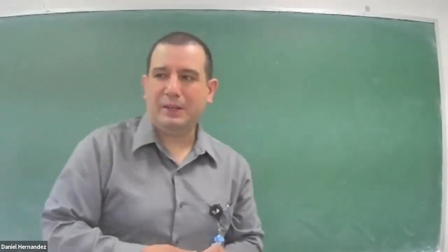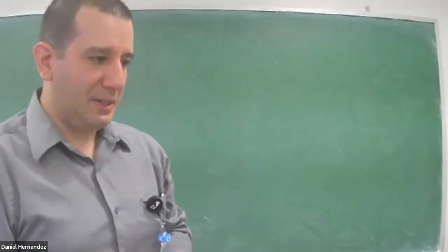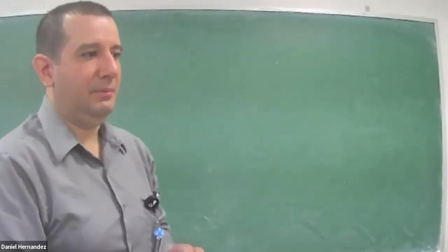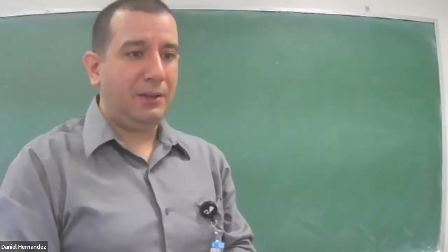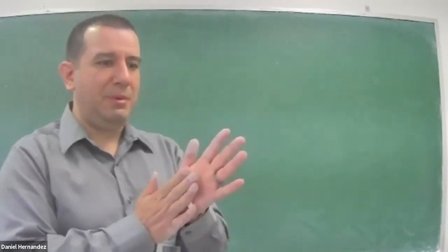Oftentimes the pediatric radiologists are going to come in. A lot of times they'll be present for these exams. Sometimes they may want to scan them themselves. So again, it all depends on your lab and your situation.